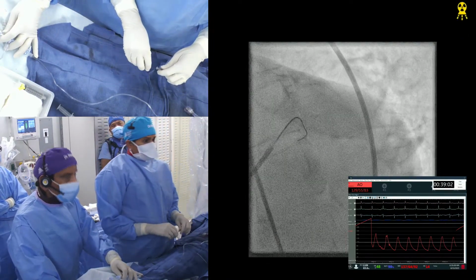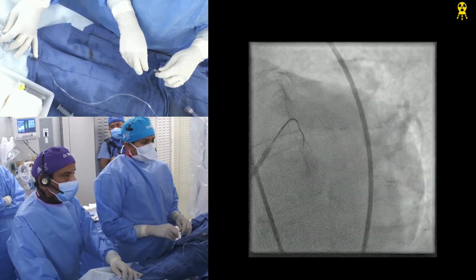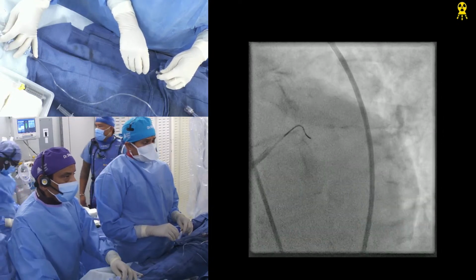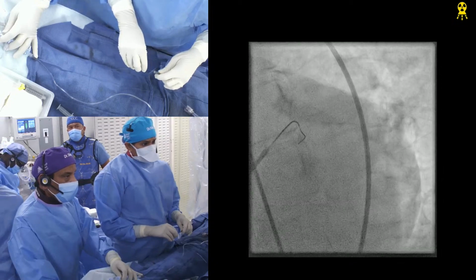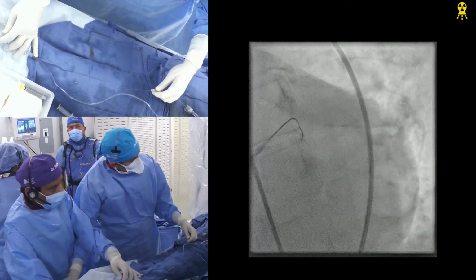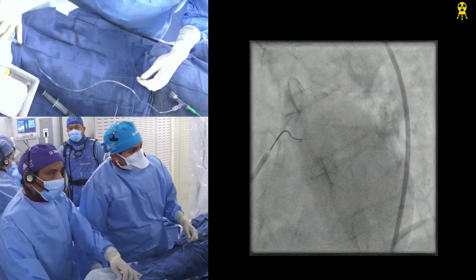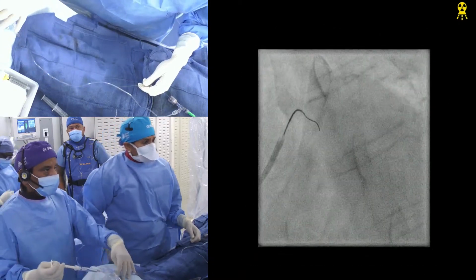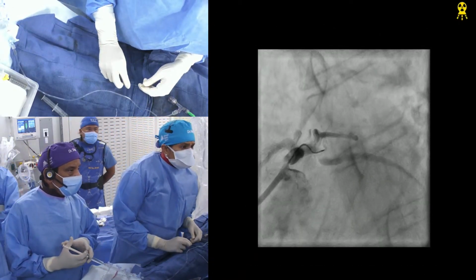I'm thinking, do I go Miracle? Give me Miracle 3. You have to see some other view, are we in the branch or the main vessel? That's the key. So I think this is the whole case. If you're in the branch and you're going with the wire, there will be more trouble. Okay. Want to go magnify? Yes. Okay. Magnify. Another view will help here. Ready? Yep. This should show it.